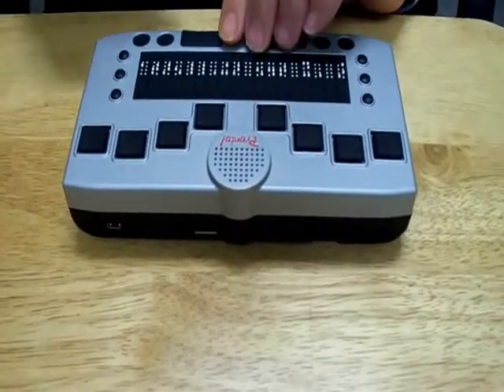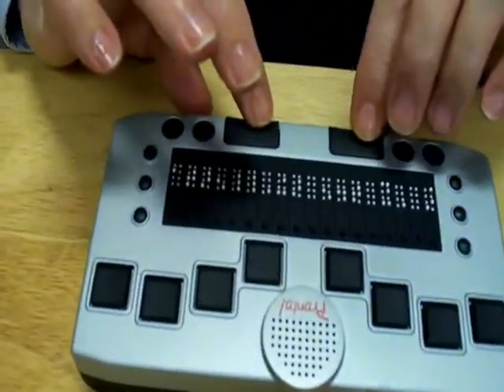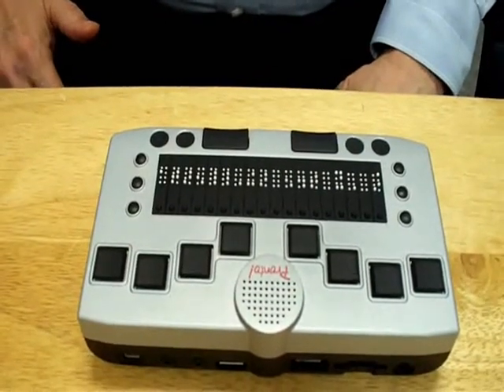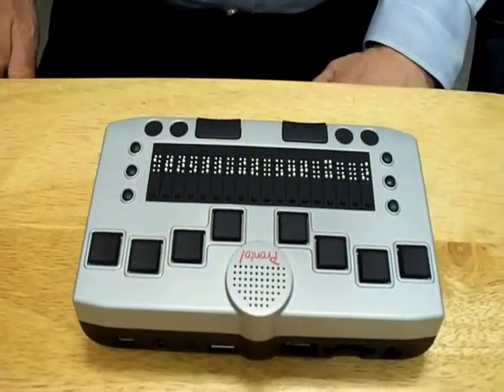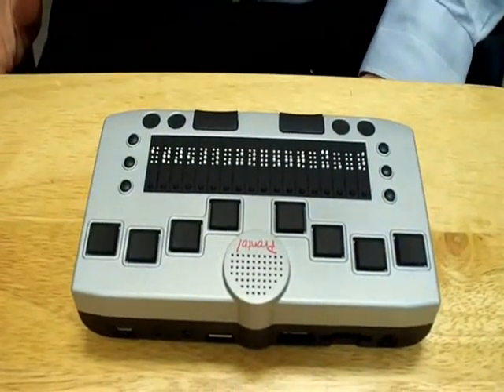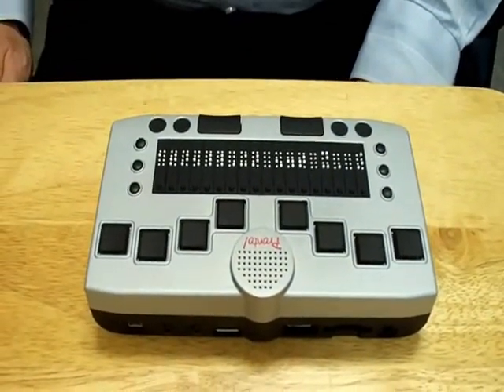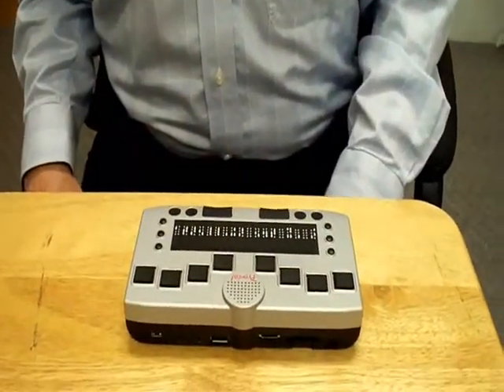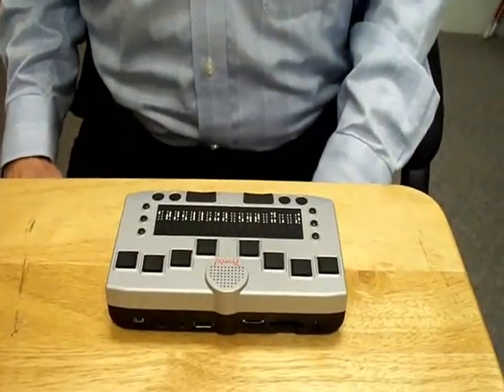Now we go to the center of the unit near the very front, and you'll notice there are two small bars. There's the left space bar and the right space bar. Each has its own function, and they will be described in other training sessions, other tutorials, and of course they're described in the manual in detail. The left space bar is referred to as B9, so Braille key 9, and the right one is referred to as B0, or Braille key 0.